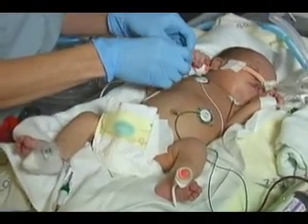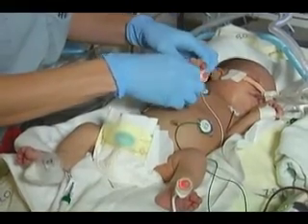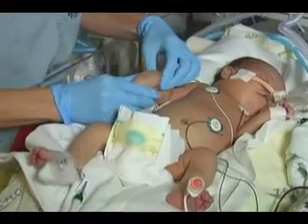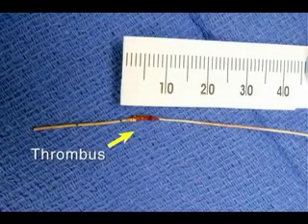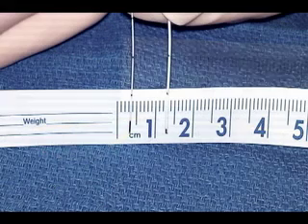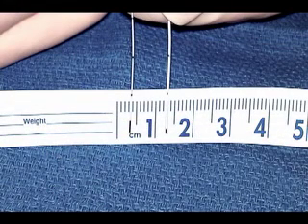Examine the patient to determine the options for vascular access. Determine the size and number of catheter lumens needed for the patient. Use the smallest diameter possible to decrease the risk of thrombus formation, and use the catheter with the fewest number of lumens possible for patient care. The use of lumen sizes 2 French or smaller is associated with the risk of blood cell lysis and catheter occlusion. These sizes should not be used for routine blood draws or the routine administration of blood products.